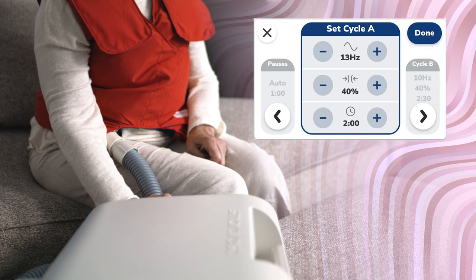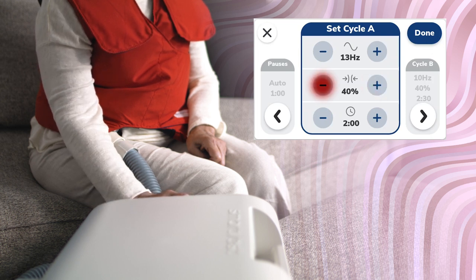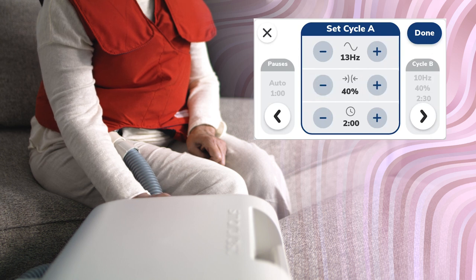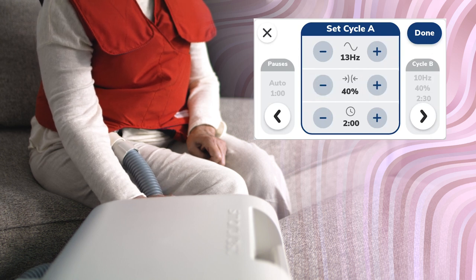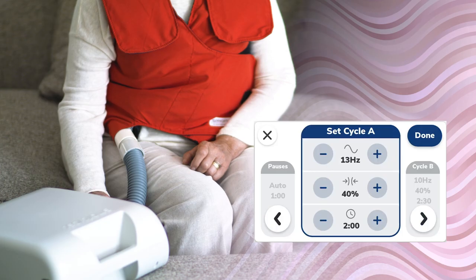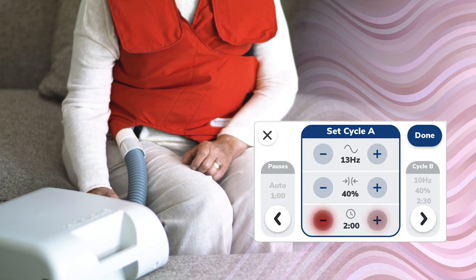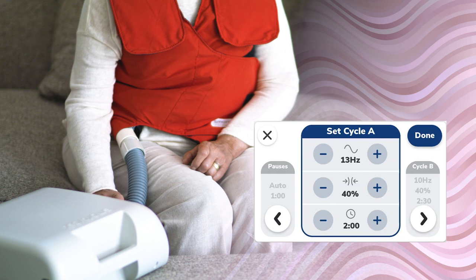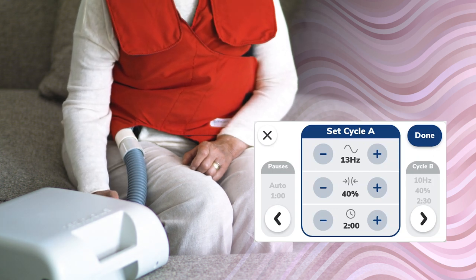To adjust pressure for cycle A, tap the plus and minus buttons. Pressure can be adjusted in increments of 5% from 10 to 100%. To adjust therapy time for cycle A, tap the plus and minus buttons. Time can be adjusted in increments of 30 seconds, from 1 minute to 60 minutes.